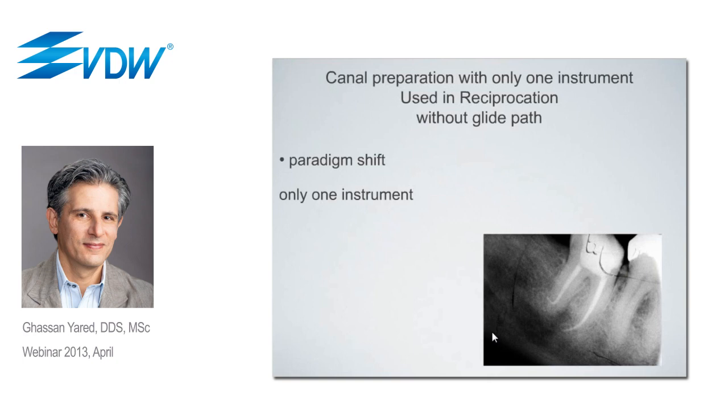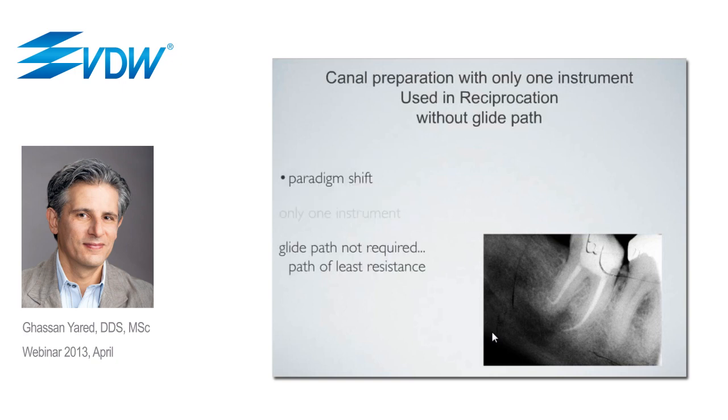So this new concept is a paradigm shift. It is a paradigm shift because it goes against the current teaching standards, which require us to use sequentially different instruments to obtain the desired shape. In this new concept, we are using only one instrument.